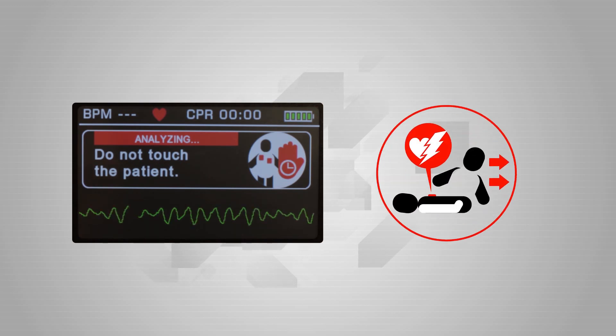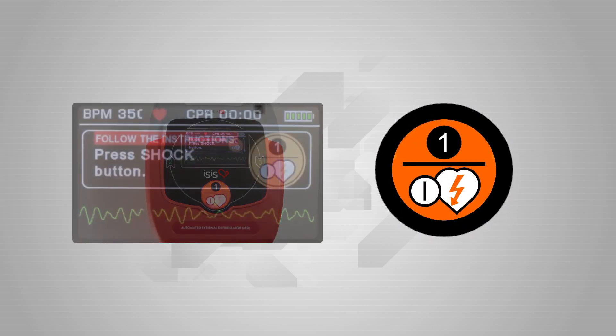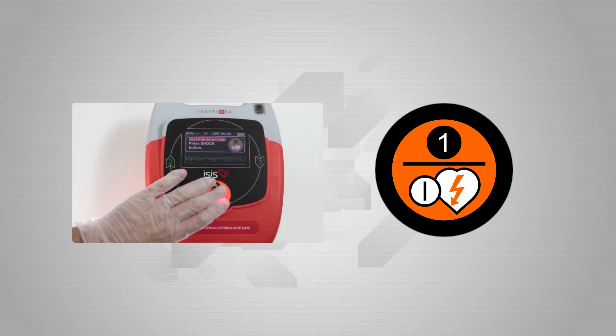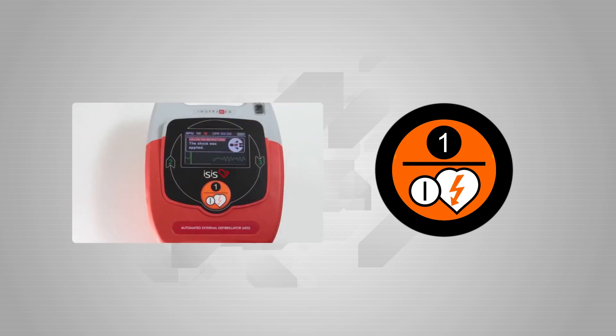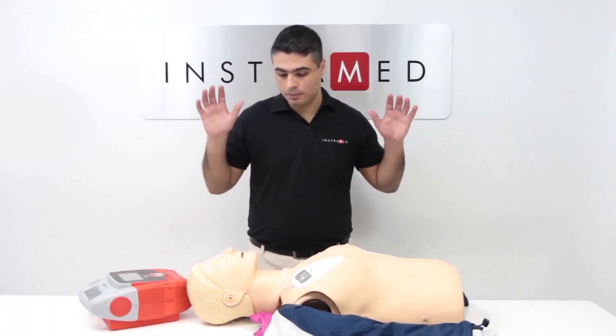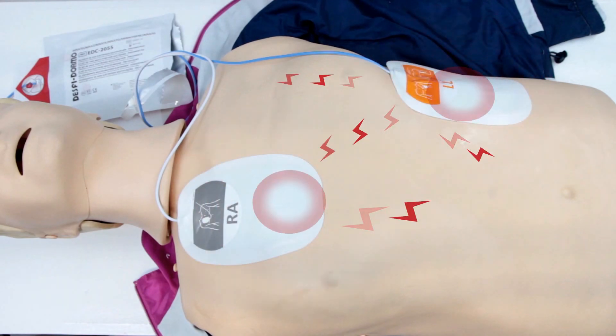Follow the visual and audio instructions. If the need for shock is detected, the shock symbol will blink and the device will prompt the user to press the Start button again. Press the Start button, and be careful not to touch the patient or the conductive surfaces in contact with them, or else risk receiving a powerful electrical discharge.